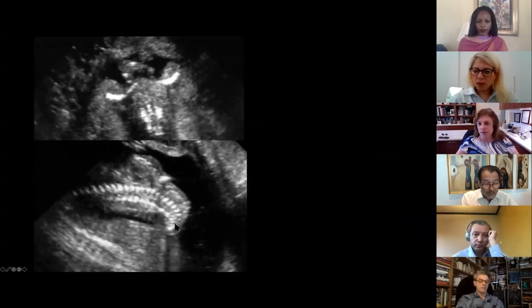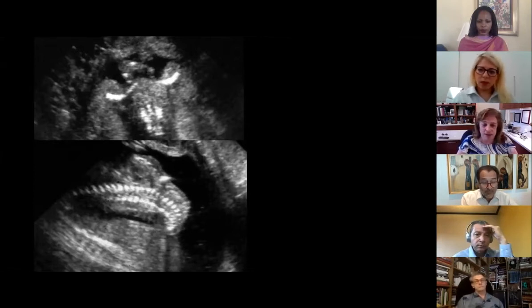Now, I'm going to end with the most extraordinary case that I've ever seen. And it pertains to the face. This was somebody that came in, and this was an old case, a long time ago, for an elevated MS-AFP. Yes, that was way back when we used to do scans for elevated maternal serum AFP, and we found that the fetus did not have a head, and yet it was alive. It was moving around. It had club feet, but it did not have a head.